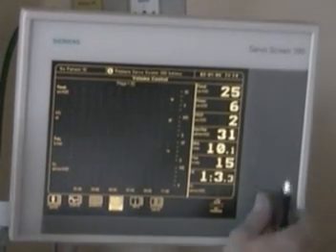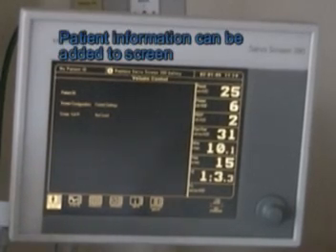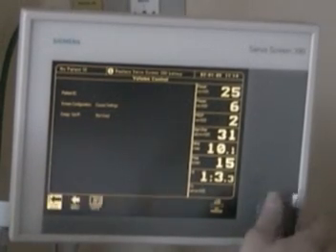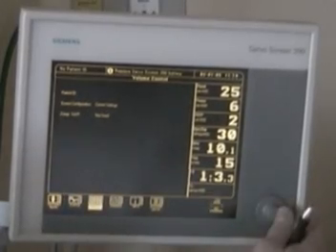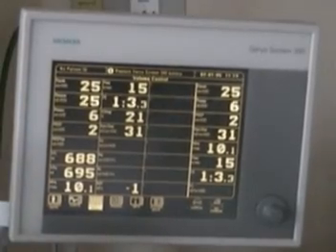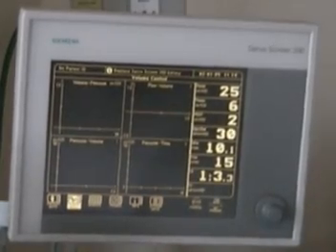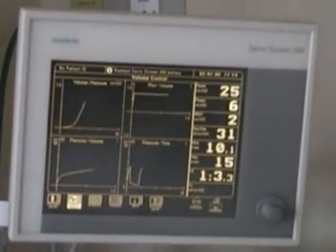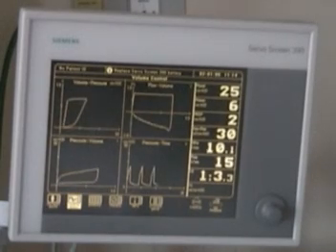You can also put in some patient information if you want to have a patient ID, etc. I think that at this point is enough information to get your basic understanding of the graphic screen on the Siemens 300 ventilator. We're going to leave it in this waveform, and that completes the overview of the Servo 300 display screen.